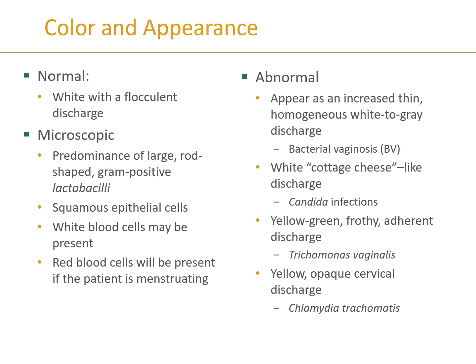You may have white blood cells present. That doesn't necessarily mean there is an infection, but if you have a very large increased number of white cells, it could alert you that something is going on, some type of inflammation. And of course, red blood cells could be present if there's menstruation or any kind of vaginal trauma or tears. Also, occasionally some people have kidney stones so bad that their urethra will actually leak, so you could get some cross-contamination there as well.